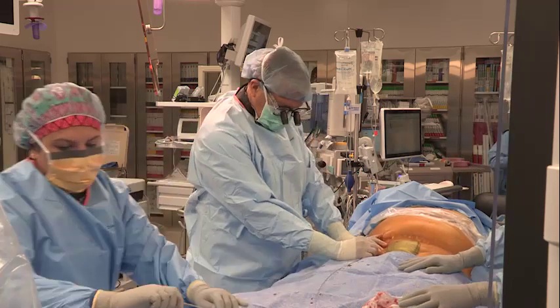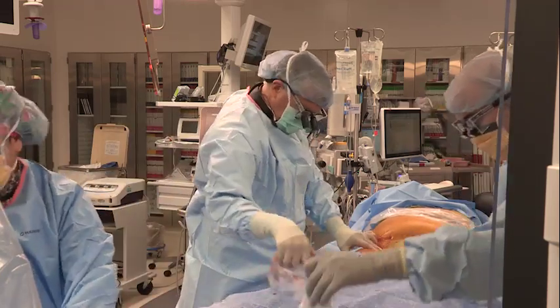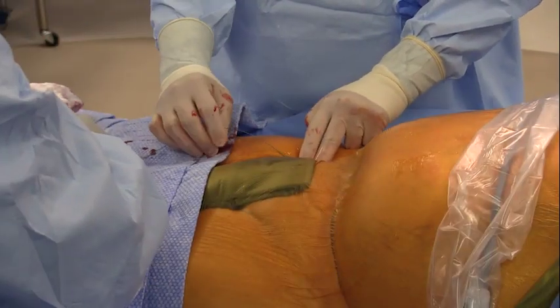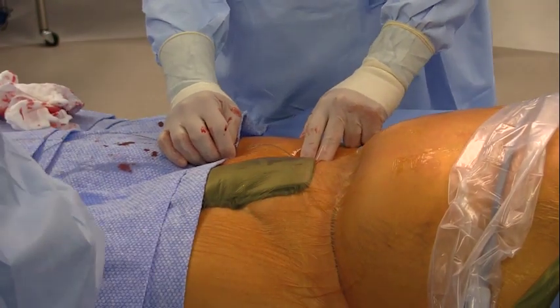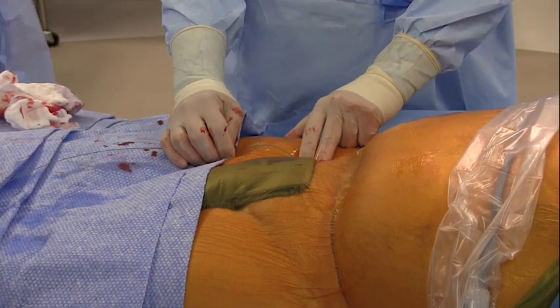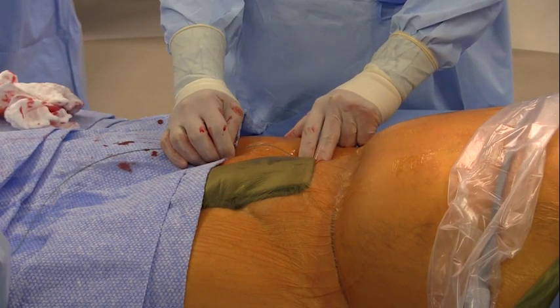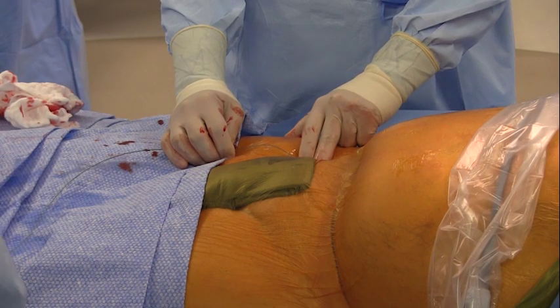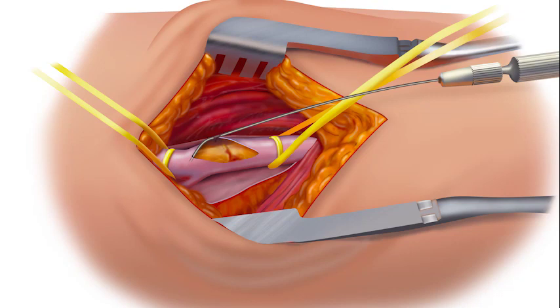Percutaneous access may be used in femoral arteries that have adequate lumen size, usually 5 mm or greater, to accommodate and introduce a sheath or bare device. If lumen size is inadequate, a surgical conduit or endoconduit may need to be placed instead. Another method to access the femoral artery is via open cut-down, in which an infrainguinal incision is made, followed by dissection down to the artery and arterial puncture.